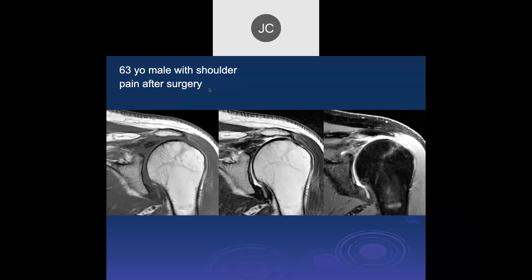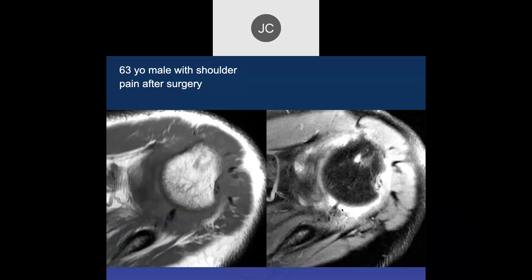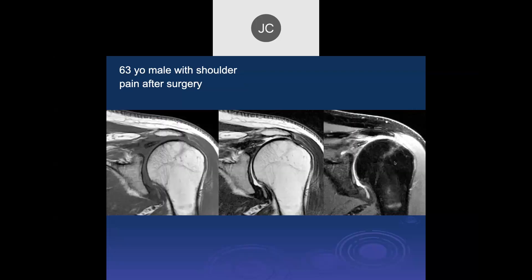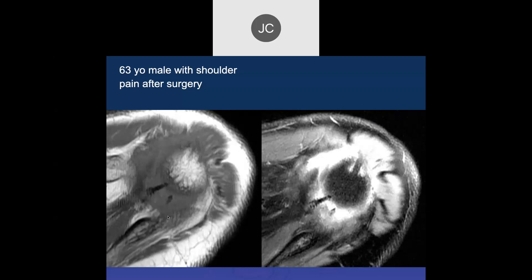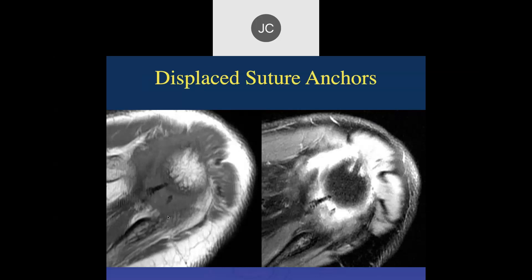This patient had surgery. What's this? That's not a bullet — that's the anchor. Here is the side where the anchor was put in, and here we can see the anchor back here. So that was a displaced suturing anchor.